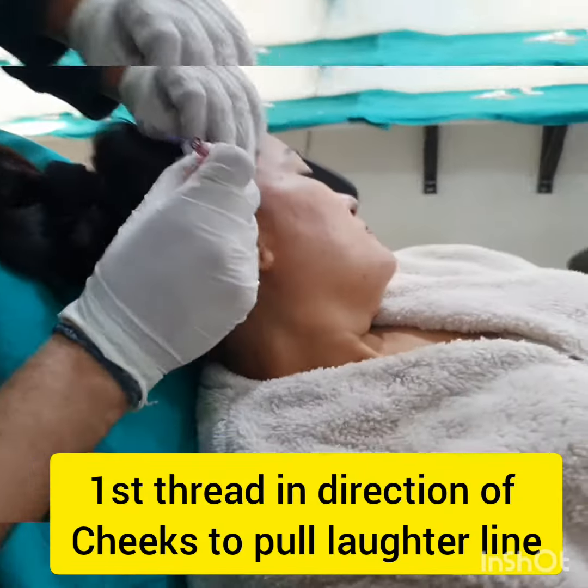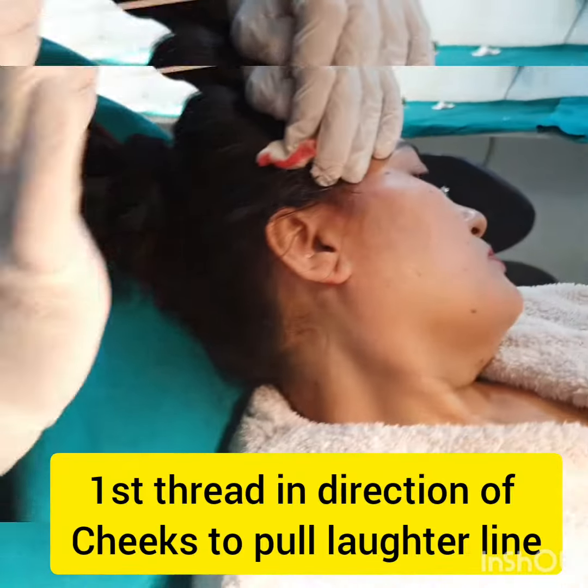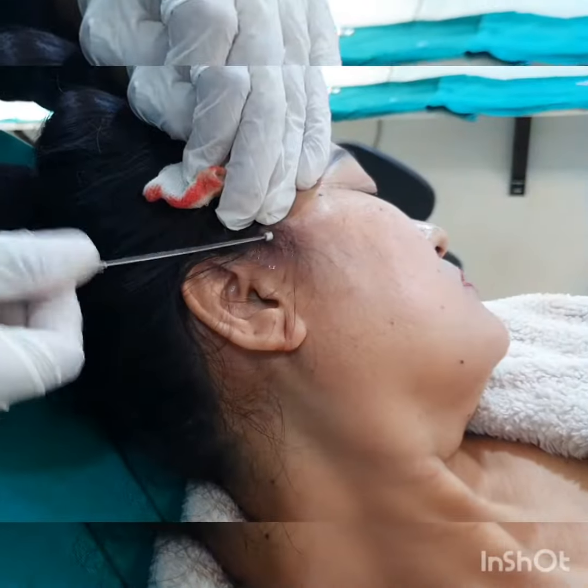It is essentially painless — we hardly use any amount of local anesthesia at all. These are the cog threads which I prefer to use. The first thread is passed from within the hairline so there is no scar.